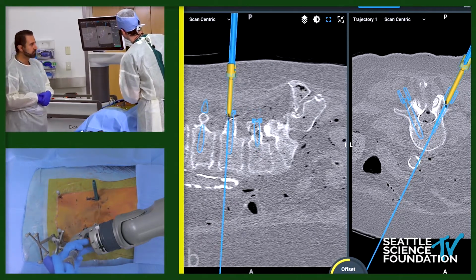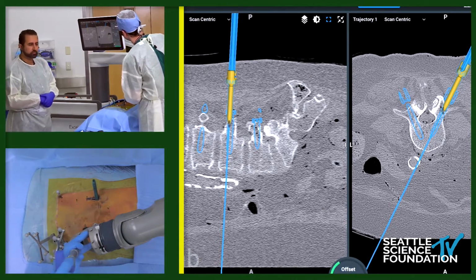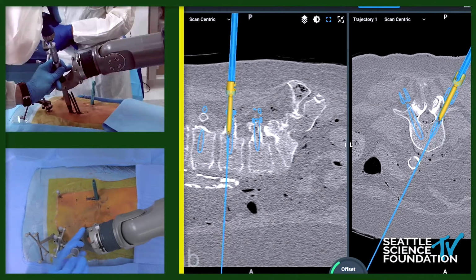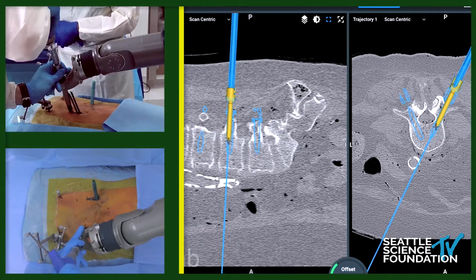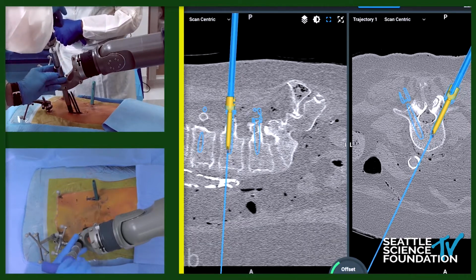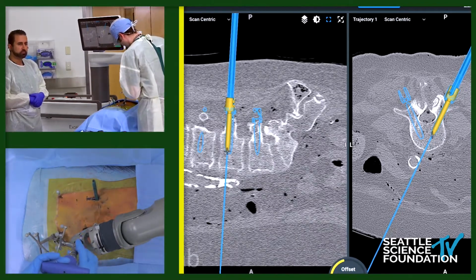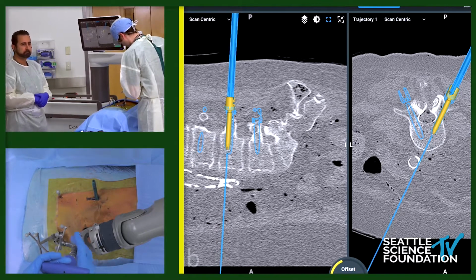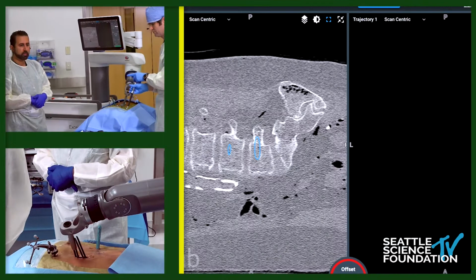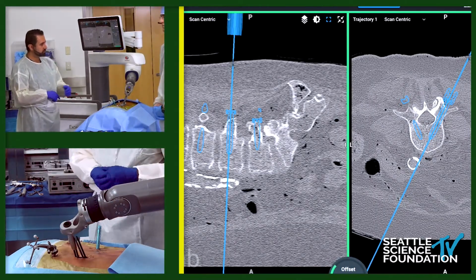Like, for example, right here, what you're seeing, you're a little bit high in that pedicle. So if I did a freehand navigation case, I would compensate. I get the tactile feedback. I compensate on the screen, and I would direct the screw a little bit lower down. But I get that tactile feedback always, all the time, and I think that's really important with navigation. With robotic surgery, you're totally losing that. So you really need something that's like 150% safe when it comes to skiving protection.